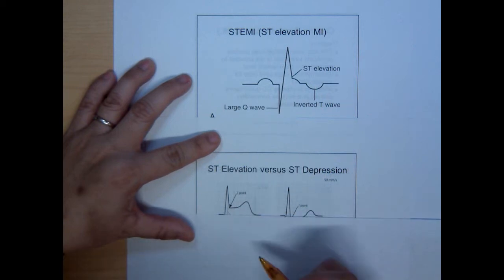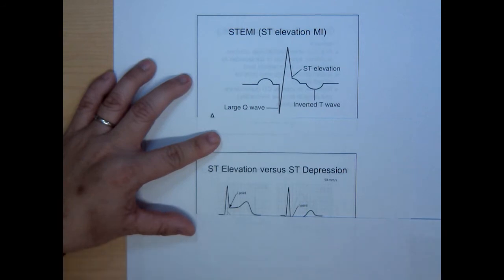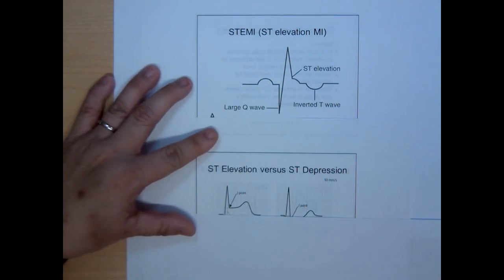You're not going to have to measure; you can kind of eyeball this. Clearly, this is 5 little boxes on an EKG. You have an ST segment that is not near the isoelectric line. In other words, it's caused enough damage here that it didn't relax itself. The body is trying to perfuse, it is trying to contract and relax, but because now you have some dead part of the muscle with a release of cardiac enzyme, it shows up on the EKG waveform as actually damage.